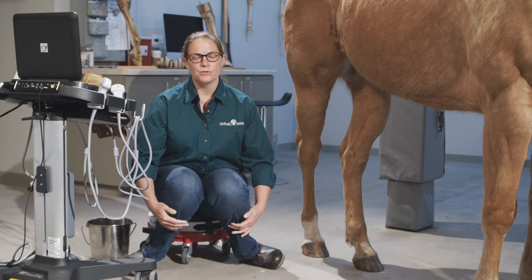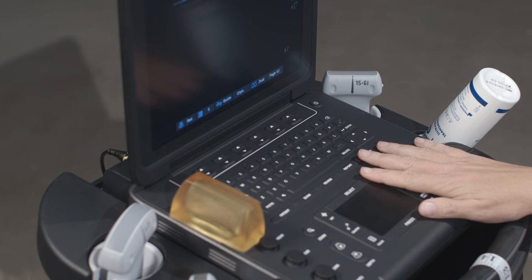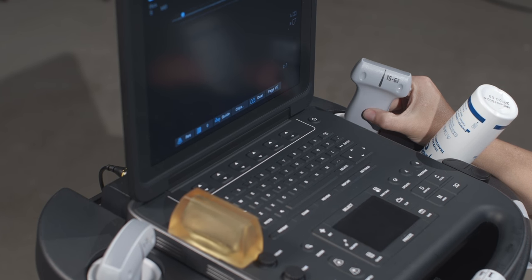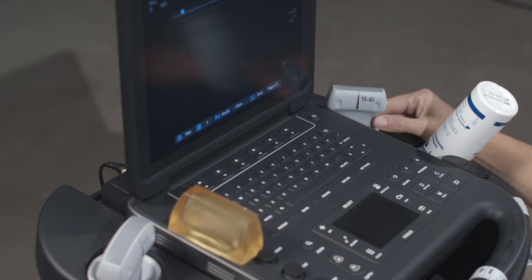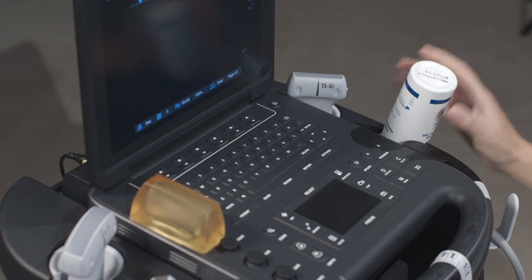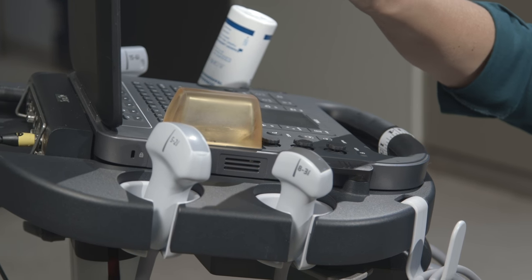In ultrasound of the hindlimb suspensory, there are a number of tools that will help you document any injury you might find and also help you get a good image. The first is a good quality ultrasound machine. The second is a linear probe — this is a 15 megahertz linear probe. The third would be some good quality ultrasound gel. A standoff is often beneficial, especially in smaller horses.